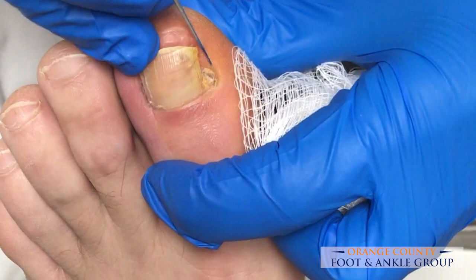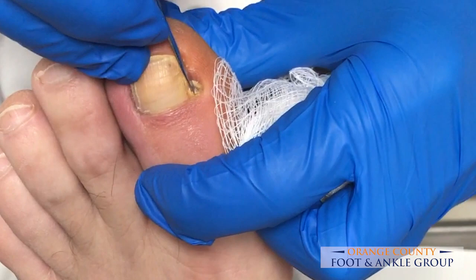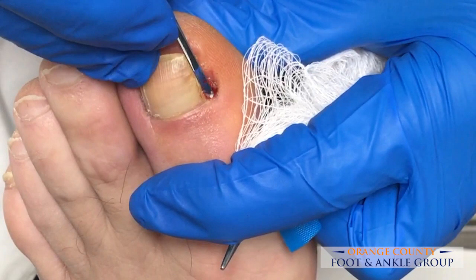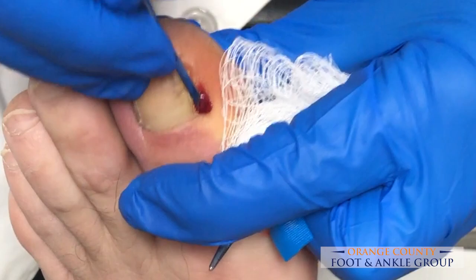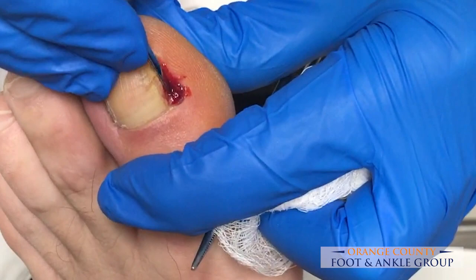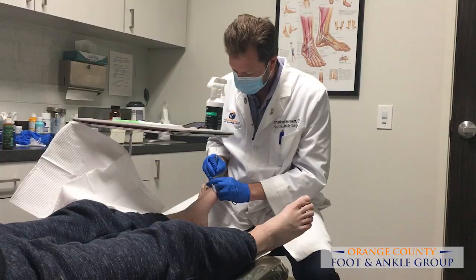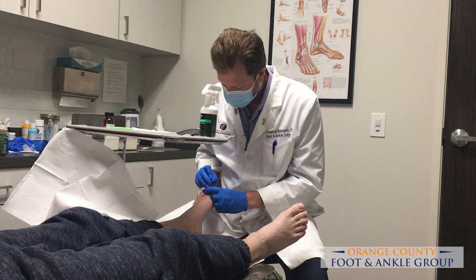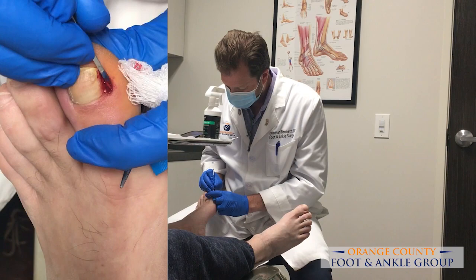Once we really isolate this nail spicule that keeps wanting to grow back, we'll pull it out. Even though you have a tourniquet on, you're still going to get some bleeding because we didn't exsanguinate his toe, so there's still blood in his toe, but there's no new blood coming down because of the tourniquet. It's a lot easier with the tourniquet because you can imagine how much bleeding there would be without it — it really obscures your vision.